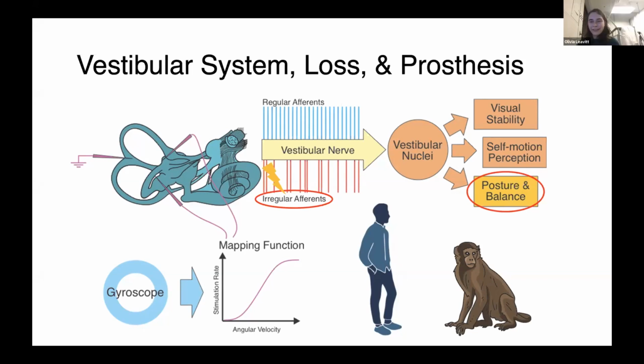I'm currently working on trying to get either an IMU or the center of mass measurements with DeepLabCut. One way that I have tried with one of our more cooperative monkeys was having a vest with an IMU on the back of the monkey in addition to on the head. I would anticipate that it would be a slightly more stable signal just because the monkey does shake his head and stuff during the experiments, but I think the head is a decent analog for now, and it's just much easier to fit an IMU to the head.